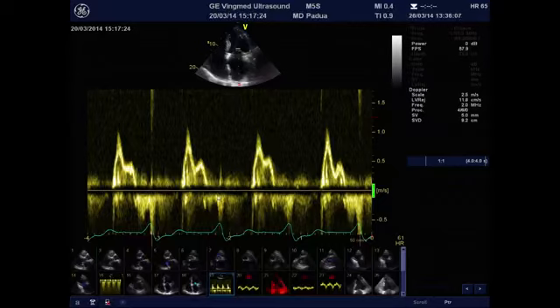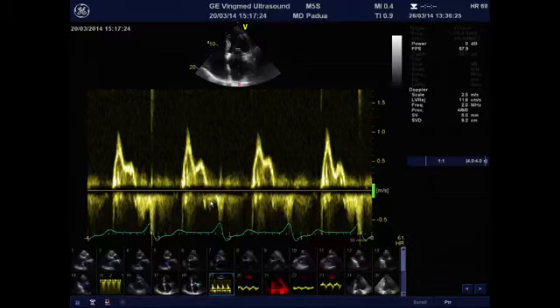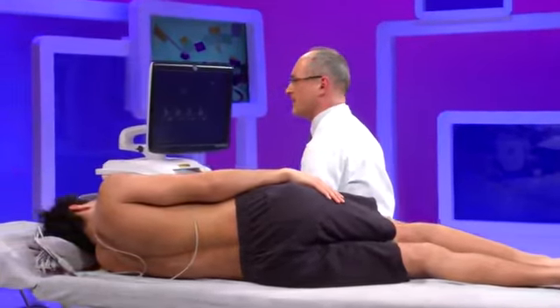Some studies have shown a high sensitivity of the changes in the filling pattern of the left ventricle to detect acute rejection of the transplanted heart, but indeed this has not been confirmed. They are too load dependent to be reliable. But however, it's very important to detect them.